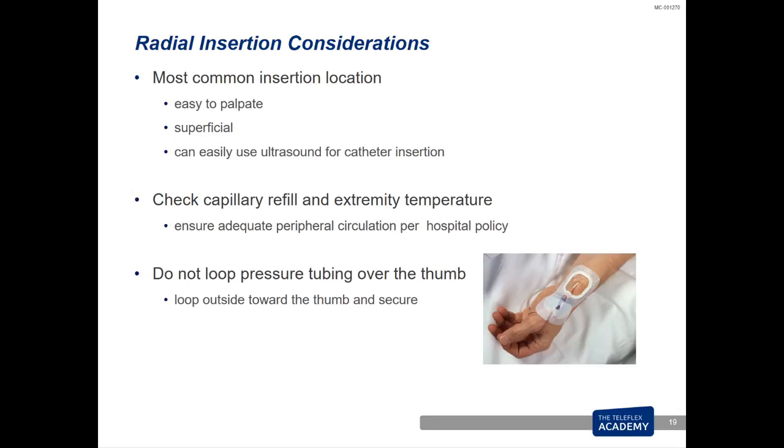When a patient goes to the operating theater for surgery, we remove their rings because we know there's going to be a volume shift in the patient during their OR visit. When the patient returns to the ICU and there's stasis in their bed and still have that volume shift opportunity, we don't want to add risk to pitting edema or function of the wrist by having the tubing looped over the thumb. And when your patient is awake, they can actually manipulate the catheter out of position just by simply moving their hand. So that should definitely be a consideration.